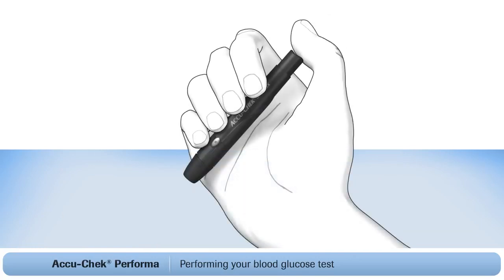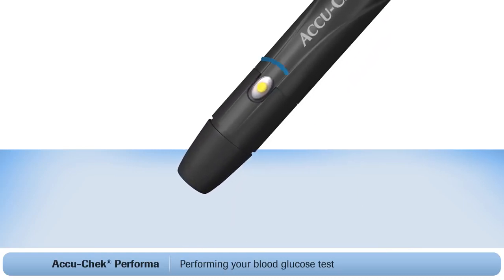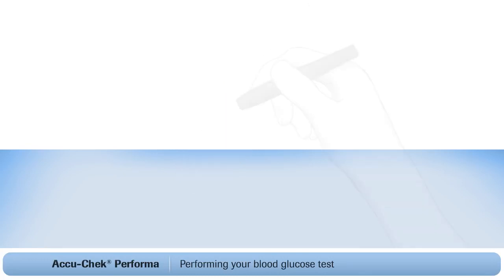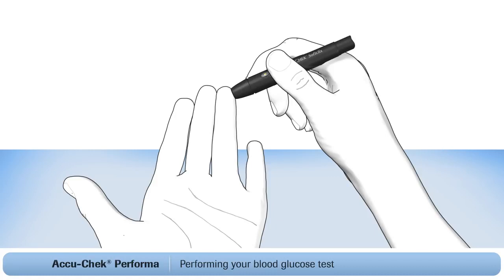Press the plunger all the way down. The release button on the side of the device has now turned yellow. This indicates that the lancing device is primed and ready to use. Press the pinhole opening on the lancing device cap firmly against the side of your finger and press the yellow release button. This will lance your finger.